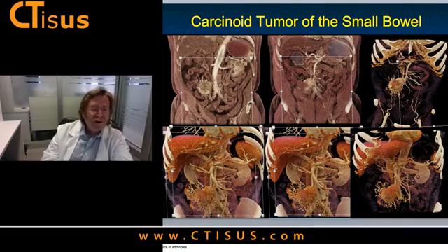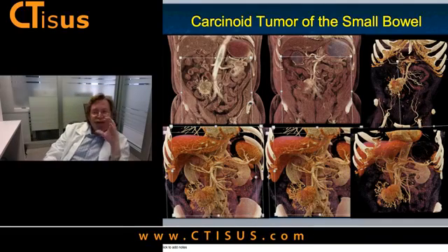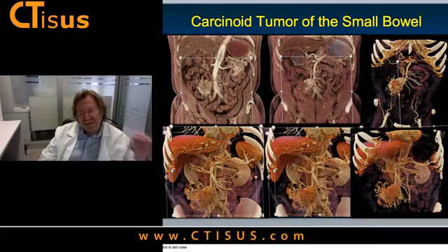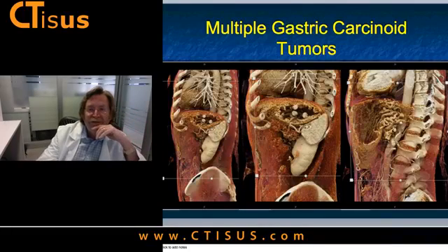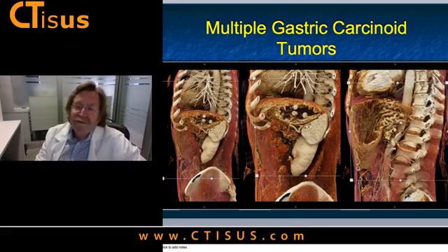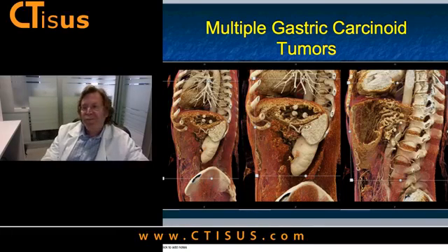And again, we're putting a lot of effort into deep learning, and I think things like cinematic, or the things that come out of cinematic like texture, are going to become very, very important. So we're looking at that very carefully. I think there's a lot of time and a lot of knowledge that needs to be gained. We're probably doing 100 plus cinematic renderings a week, maybe more than that.